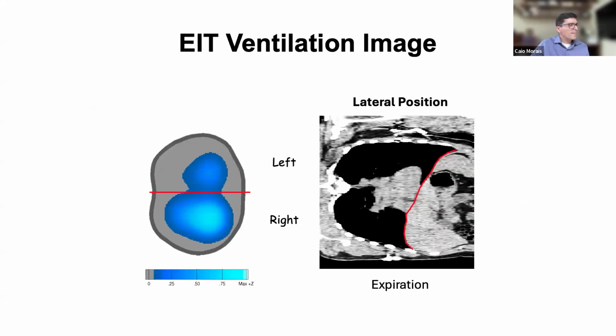And just a brief explanation. What we are measuring is pure physiology, right? Just physiology. Here I have my CT scan in lateral position with the bedside close to this right lung. And in red, I'm illustrating my diaphragm.